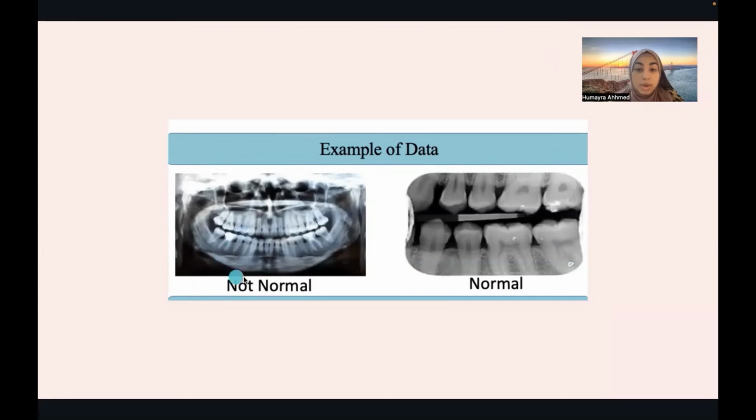Cone cuts may be caused by various reasons, the most common being that the image receptor is not in line with the position indicating device, known as the PID radiographic cone. And the collimator, which reduces the size and shape or cross-sectional area of the X-ray beam, doesn't completely expose the film, and that results in cone cut errors.